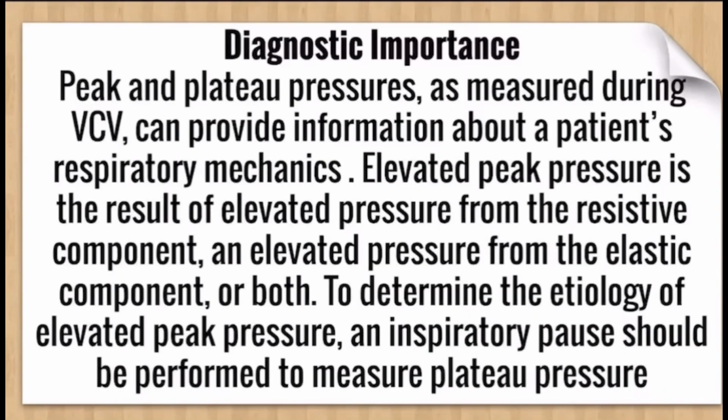Now, diagnostic importance. Peak and plateau pressure as measured during volume control ventilation can provide information about the patient's respiratory mechanics. Elevated peak airway pressure is a result of elevated pressure from the resistive component, or an elevated pressure from the elastic component, or it could be both.